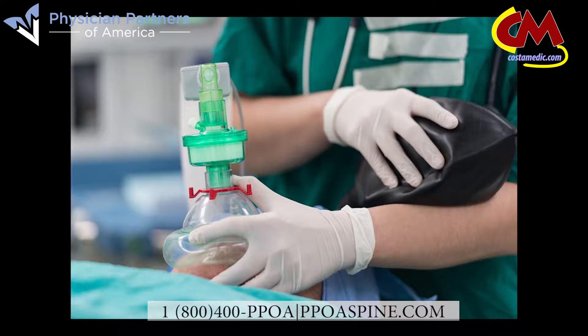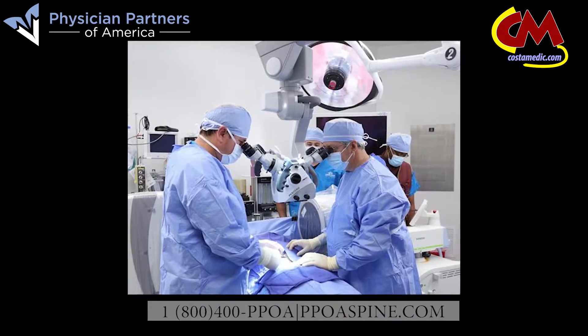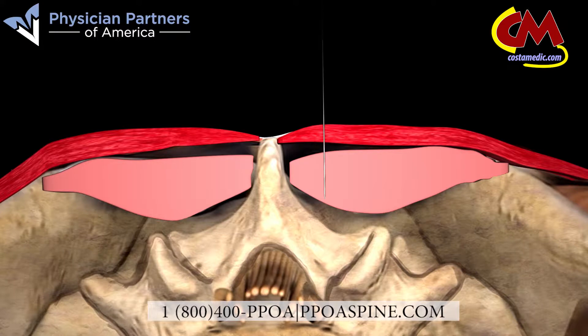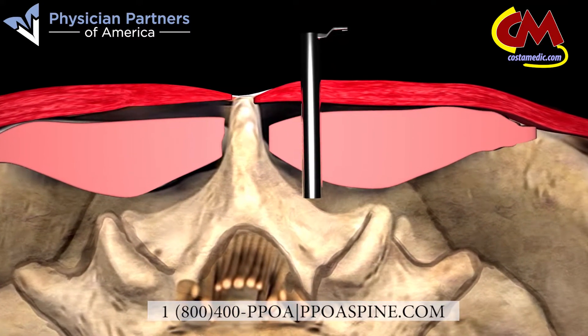After administering general anesthesia, the laser discectomy begins with our physician using an x-ray fluoroscopy to identify the entryway. An x-ray guided guide pin is inserted, and next, a series of dilating tubes, gradually increasing in diameter, followed by a working tube placed over the guide pin. This creates space the physician will use to access the treatment area, while at the same time protecting muscles and tissue from trauma.